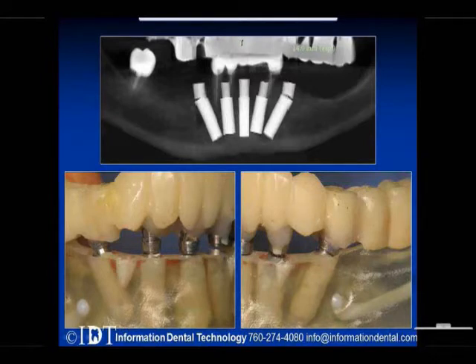So these 2 pictures depict the inaccuracies that can come from this type of method, which are very minimal for what we're doing. You know, going from just the DICOM data, reducing the bone down, placing a surgical guide on top of that, and then immediate temporization. The only discrepancy is this little gap that you see, because the model is what we did in the lab. During the surgery, we set the temporaries and used some flowable to adjust them to how the implants were actually placed clinically versus how we placed them in the lab.